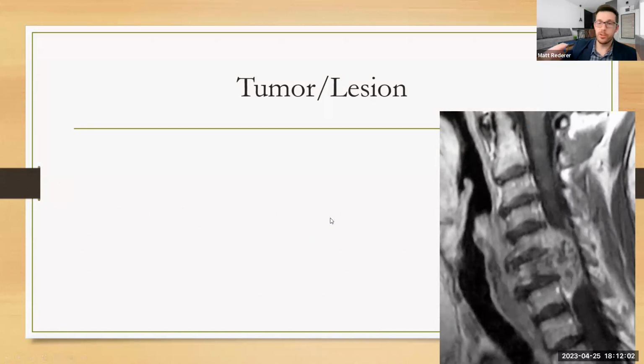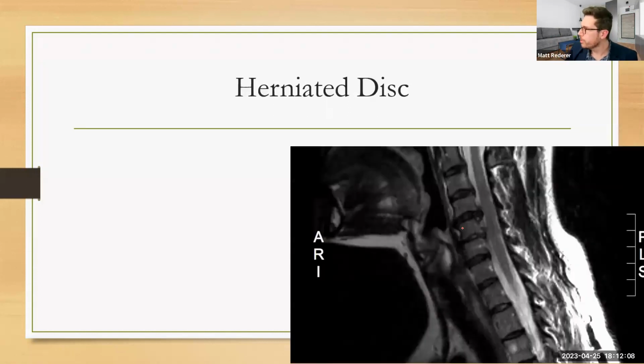And typically when we image spine, we might be looking for a herniated disc. So this is a herniated disc bulging out. All right, we see a little bit of the bulging here. We can see back up here, this posterior longitudinal ligament coming down. And we can see that posterior longitudinal ligament stretching. Here, let me erase, so you can look for that ligament. But if this protrudes to the point where it pushes on the spinal cord, we call that cord comp. If a patient has cord comp, they could be paralyzed if they move funny, if they sneeze, if they get into an accident. It doesn't take much for them to do some damage to their spinal cord.